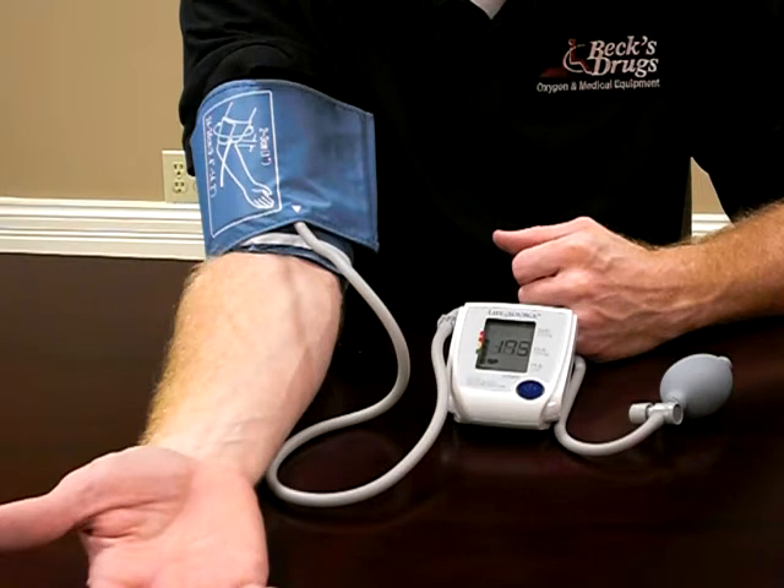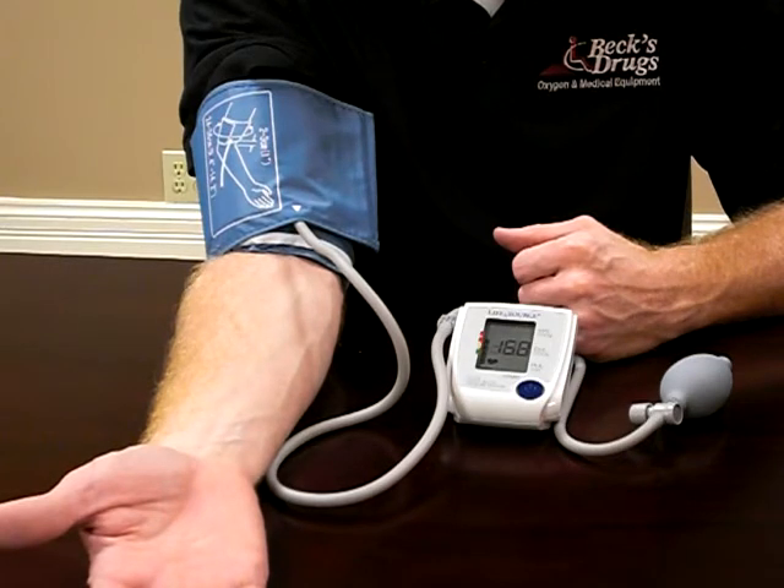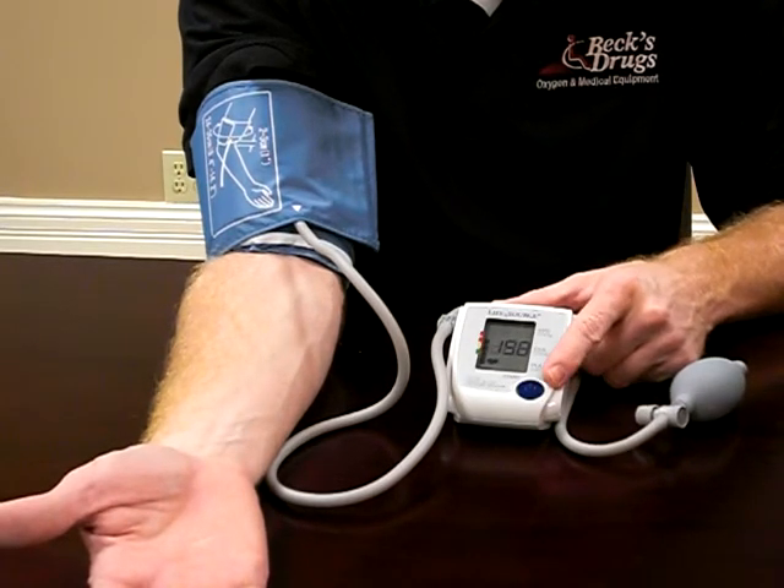If it doesn't read out, it may mean that you didn't pump it up high enough — you may need to pump it up a little bit higher. In that case, you would turn the button off, turn it back on, and try it again.